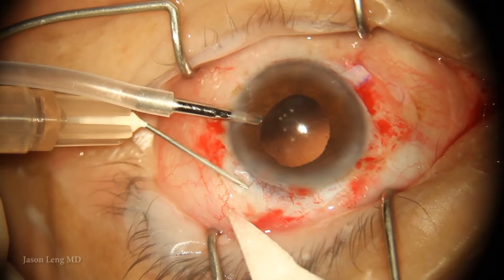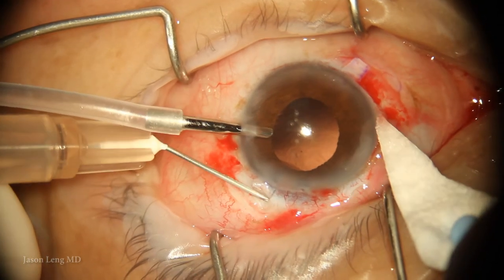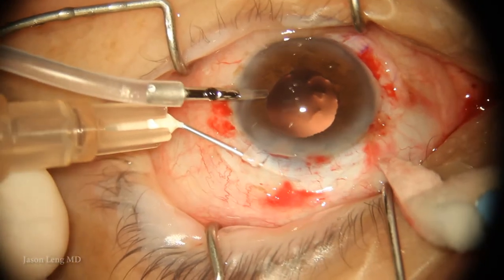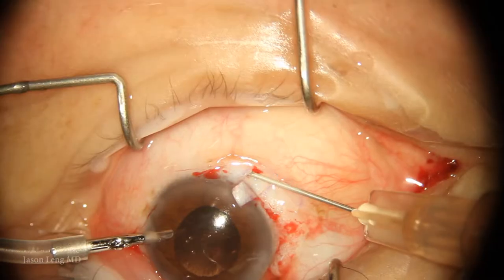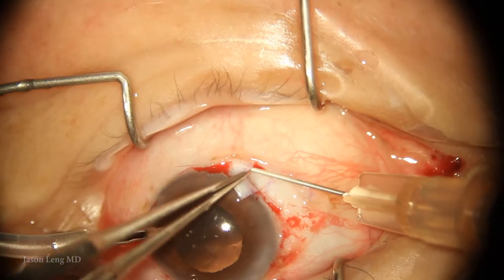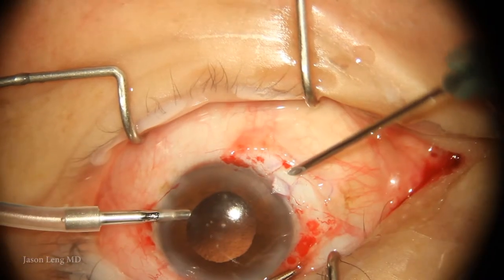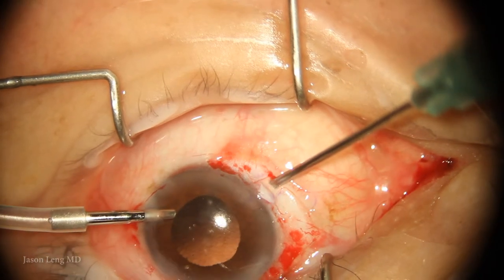I'm using a 26-gauge needle to make my intrascleral tunnels to tuck the haptics. I generally start about 1 to 1.5 millimeters posterior to the limbus and tunnel about 3 to 4 millimeters in length. I tend to err on the longer side — I've been in a situation where it was too short and had to go back and make it longer, so it's just easier to err on the longer side.